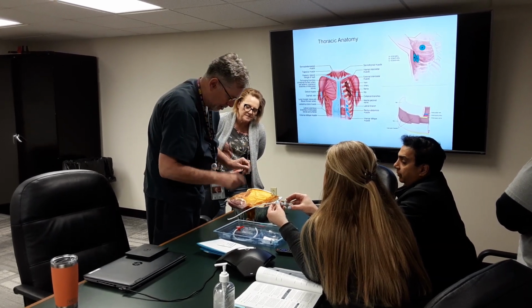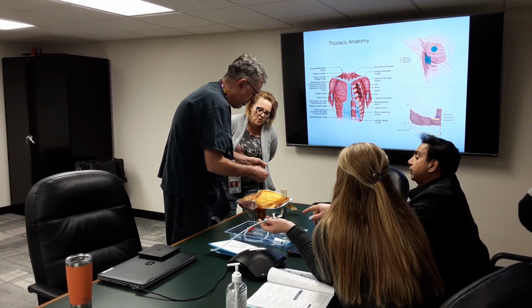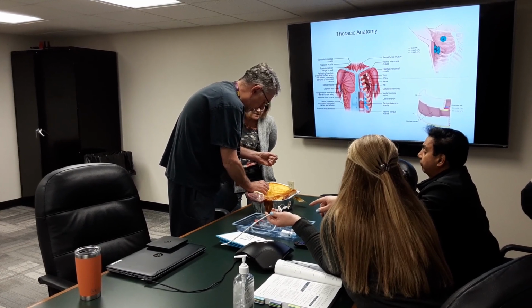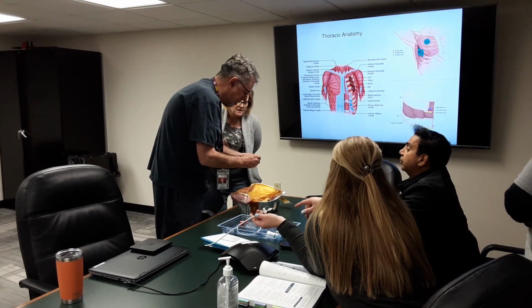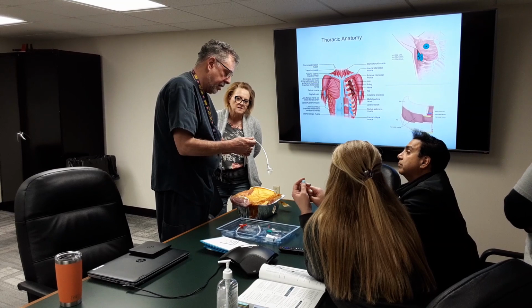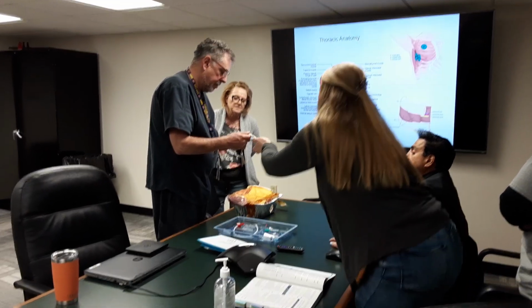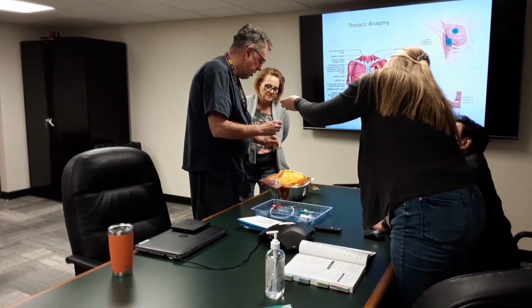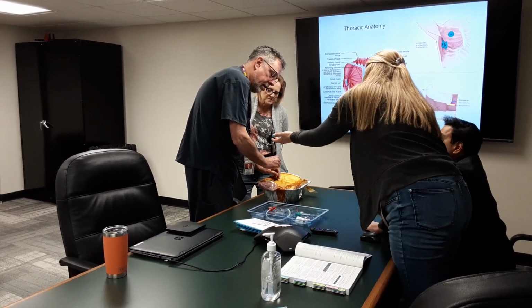Then, right at this step, I make the little incision here. And I'll just push through. So it's there. And I'm gonna have somebody help me control the other end of it. You can see the wire is really quite long. I'll push this over the top.